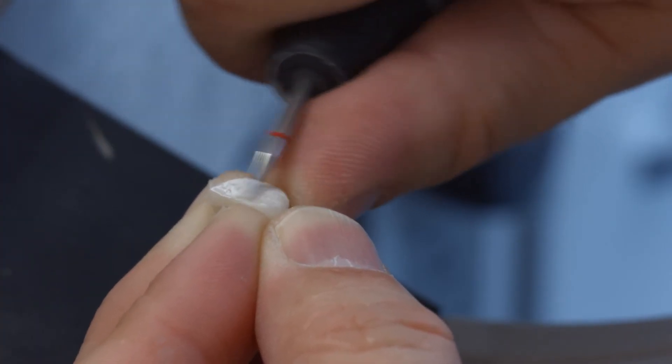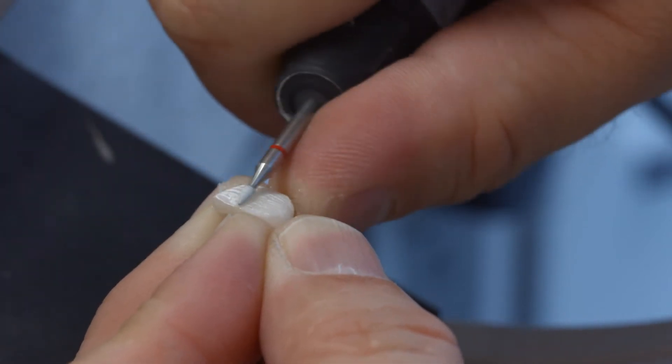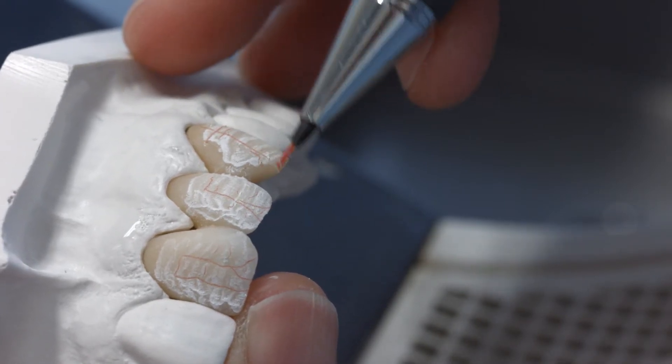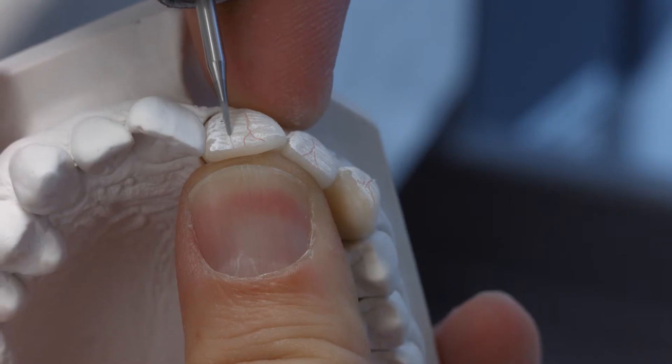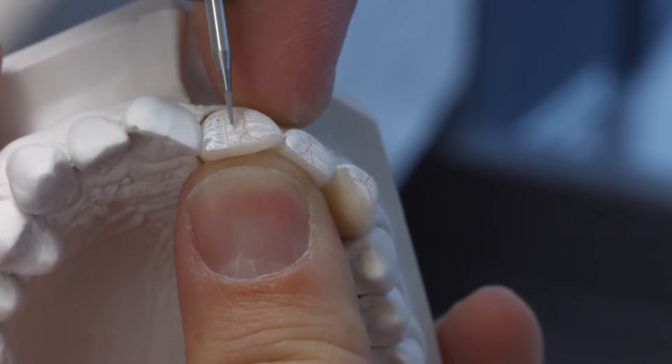After the dentin and incisal firing has been successfully conducted, the restoration is finished. Use diamond burs to give the restorations a true to nature shape and surface texture and faithfully reproduce growth lines and convex and concave areas.